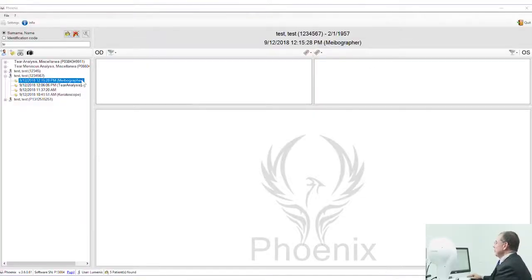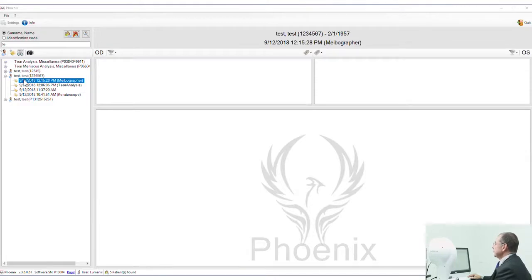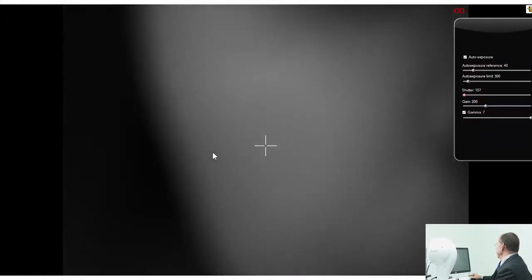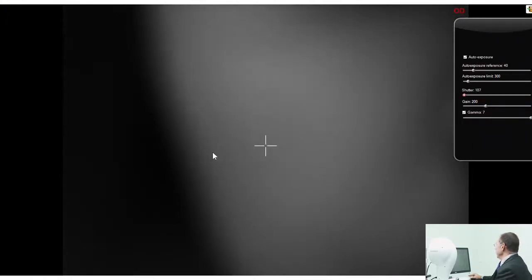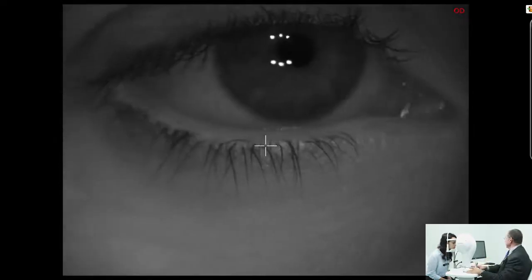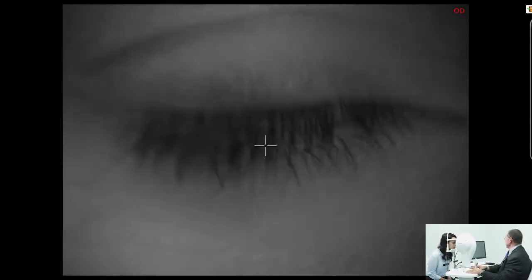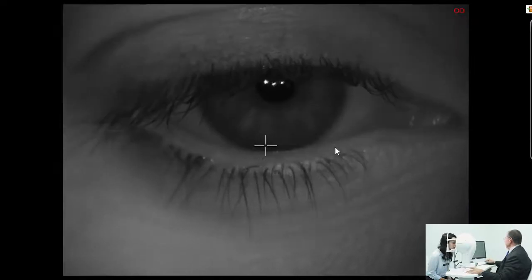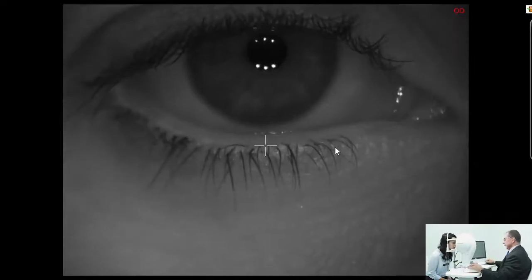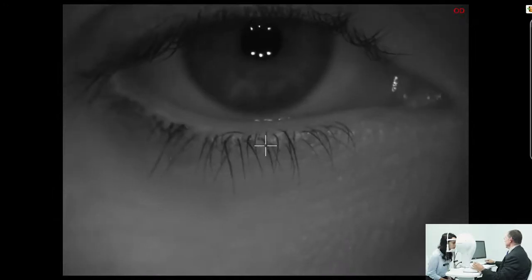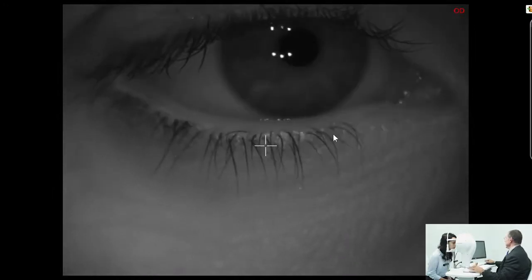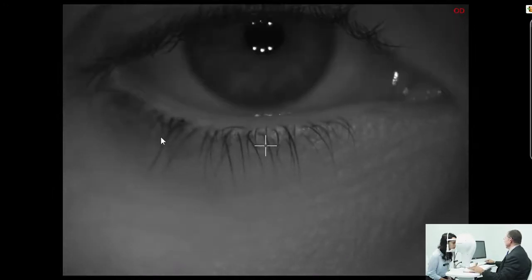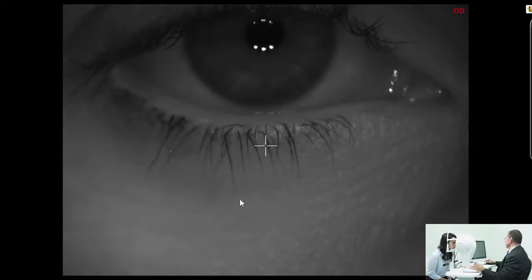We choose the meibomian gland test and we're going to get a screen for the meibomian glands. What I try and do is I try to focus before we do anything that the lower eyelid will be kind of a little bit high because we're going to actually rotate it and that will bring it more or less into the middle of the screen.